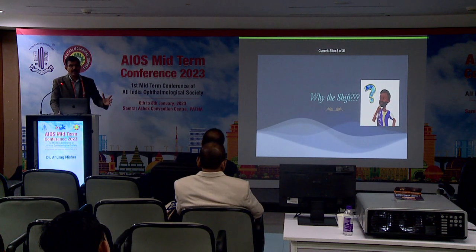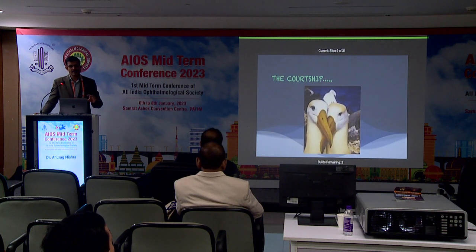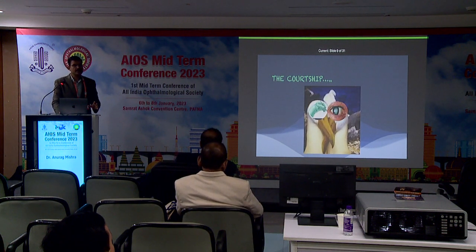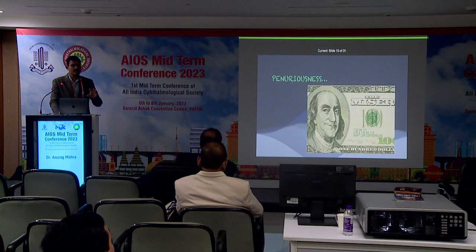The reasons why I shifted to a low IOP phaco are basically three. I consider phacoemulsification not to be a surgery. If you imagine the surgical process to be a transient courtship between the patient's eye and the surgeon's hand, then it is imperative that in a courtship, as both spouses take care of each other, they ensure that the other is comfortable. We also have to ensure that the eye we are touching and handling is comfortable. So that makes physiological IOP much more legitimate.